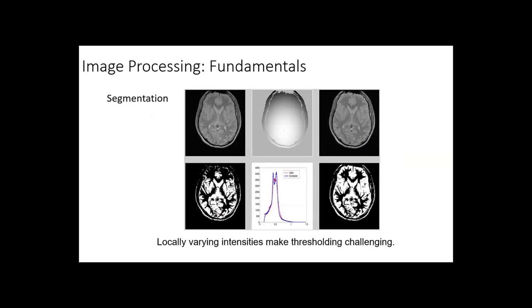Okay, yeah. So, but sometimes if you work on real images, there's another challenge. We call it the bias field. The reason for the bias field is like if you have a camera that has a flashlight, when you take the photo, the lighting condition is inhomogeneous.